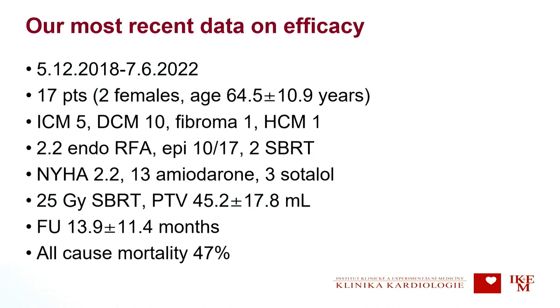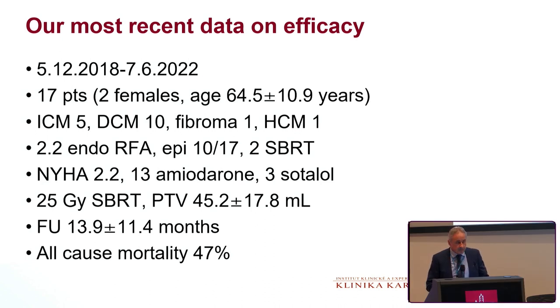We analyzed the most recent series of 17 patients who had this very precise export of data from the mapping system. They had a unified protocol for ablation in both centers. We really did ablation, repeated ablation, and when it failed, we went for radiotherapy, exporting data with very high accuracy. You see that patients had at least two ablations before, including epicardial in 10 patients out of 17, most of them on drugs, and they were irradiated. There was relatively high all-cause mortality because of heart failure, because these patients are really very sick.